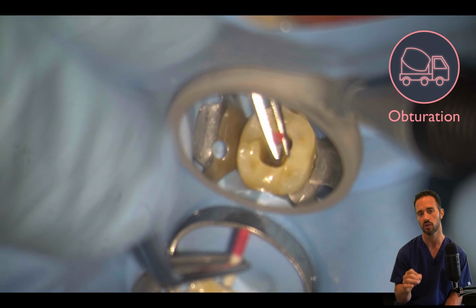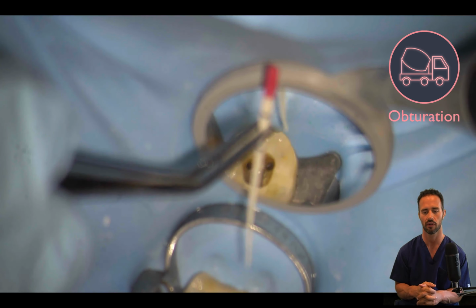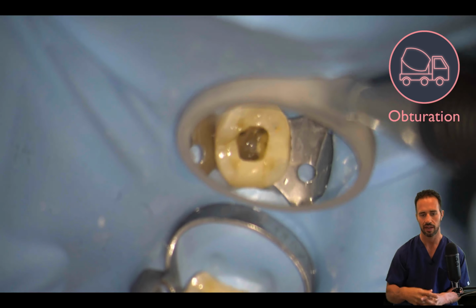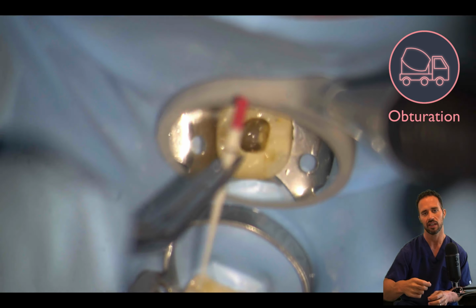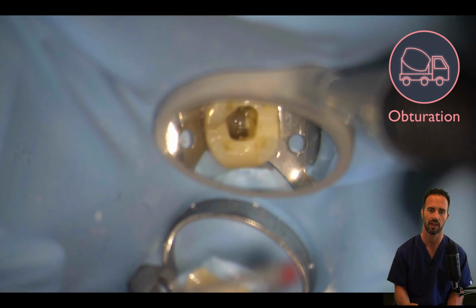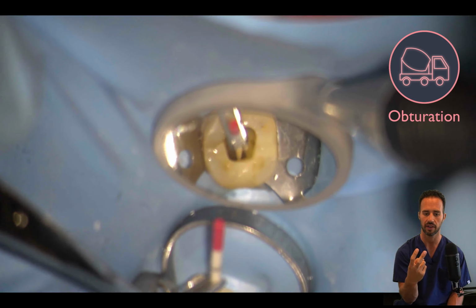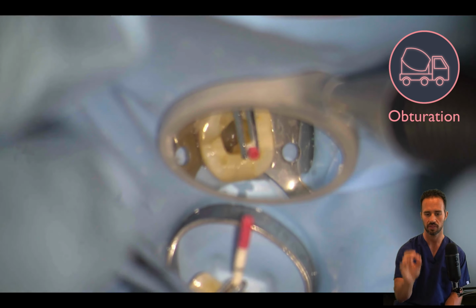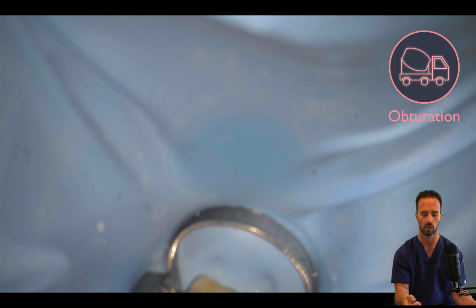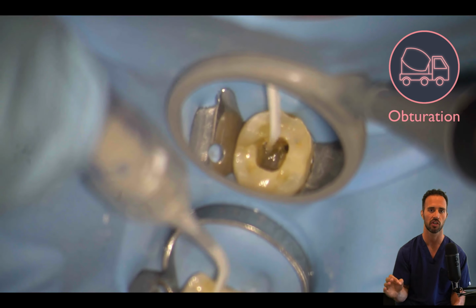All right, so these are ProTaper F2 paper points, as I use in most instances, as you already know. ML and then MB. And the dental assistant will actually pass me loaded cotton pliers with a new paper point. This way I'm not trying to grab them from the packet. We use 2 cotton pliers in each setup, and once I'm done with the cotton plier with the paper point, I hand it to the assistant, and then she'll actually hand me a new cotton plier loaded with another paper point. Same with gutta percha cones.